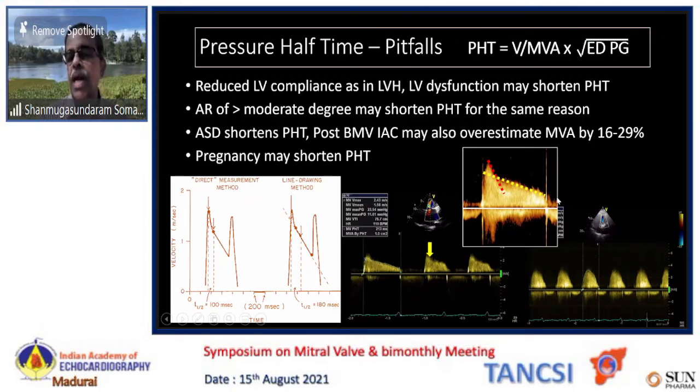On top of it, we get different shapes of mitral Doppler, the ski slope, where we are supposed to use the mid-diastolic pattern to measure the valve area. And if you get a dome-like pattern, measuring pressure half time is going to be extremely difficult.